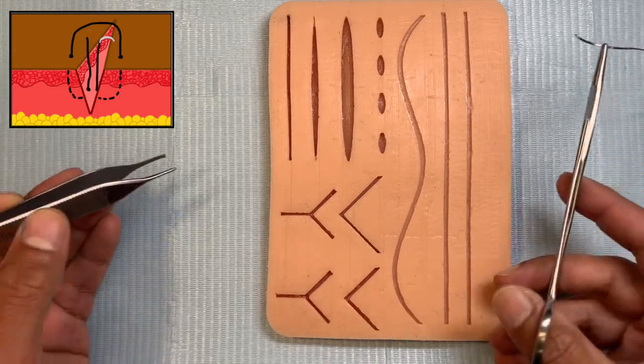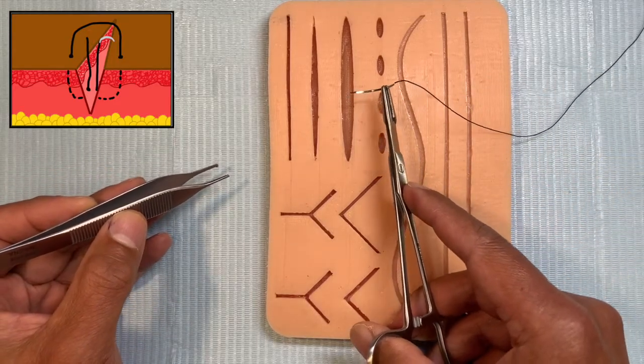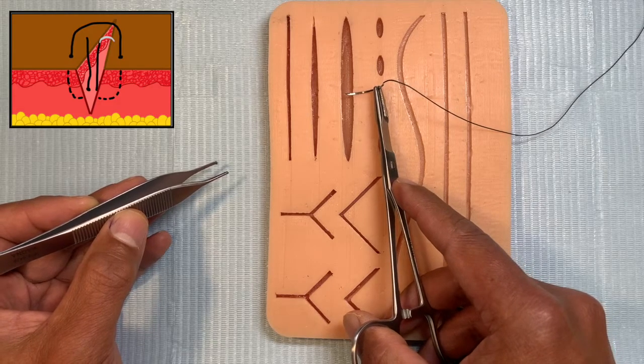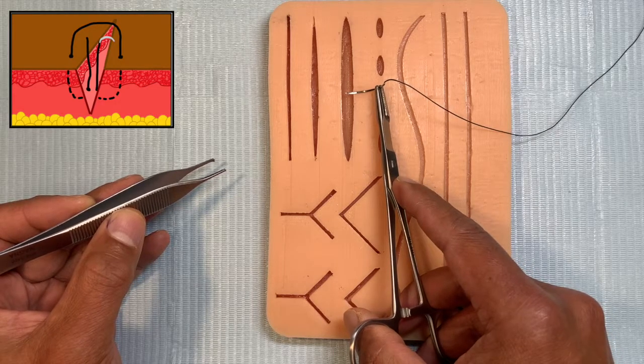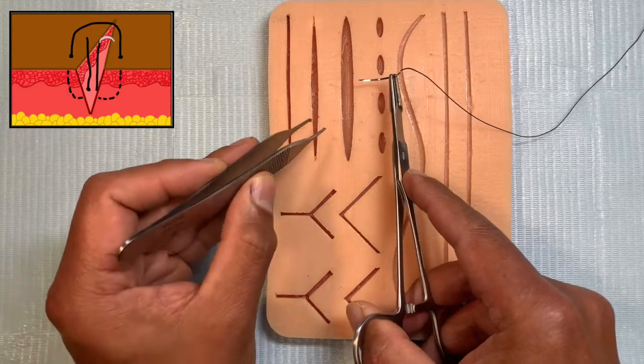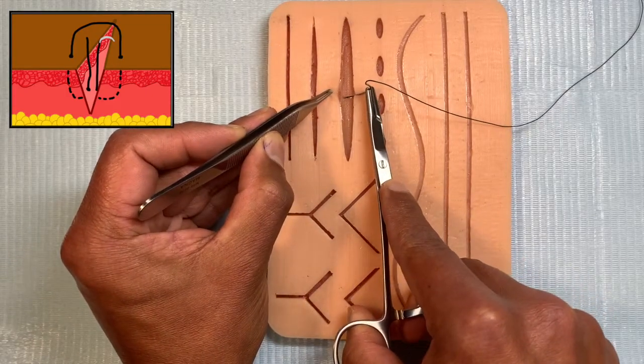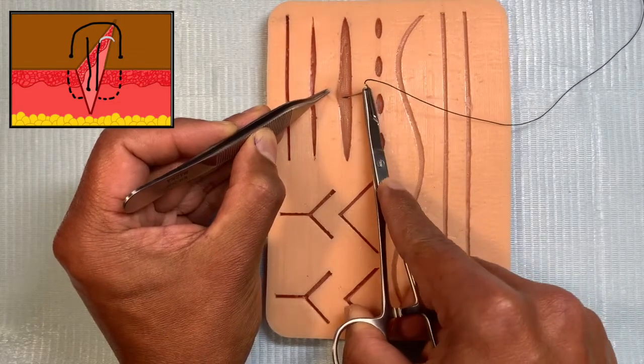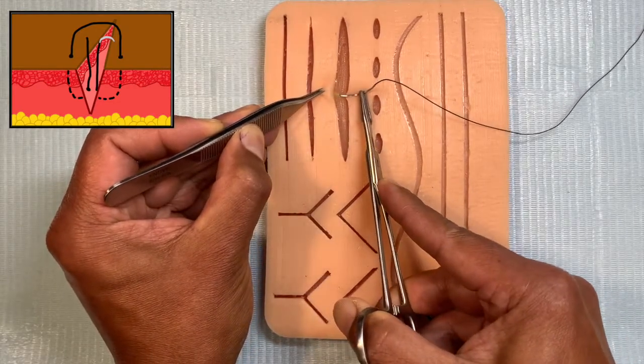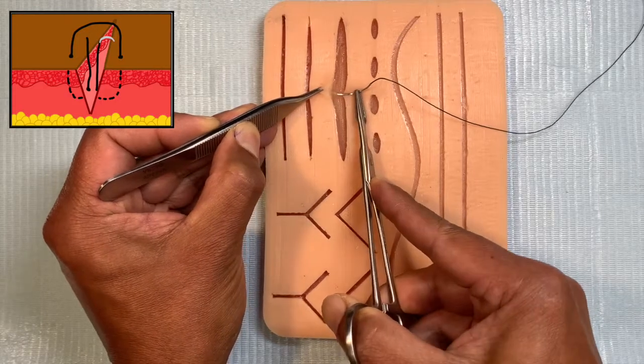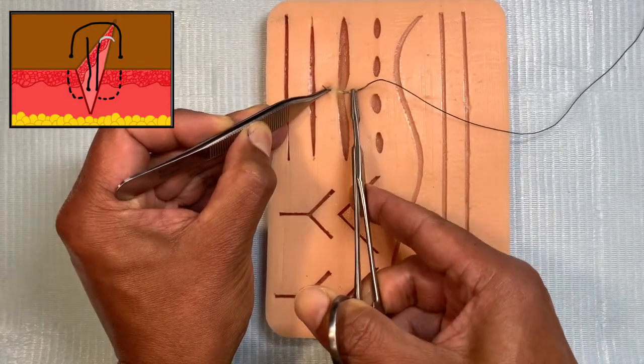So the way we want to talk about this is that the deep dermal suture is D to S and S to D. What does this mean? What we're going to do is go from deep to superficial. So you can see I'm taking my bite, I've held the needle right in the middle and I'm taking my bite from the depth to the surface.